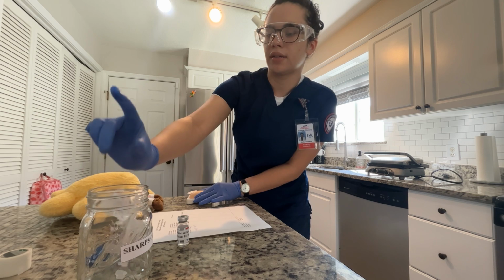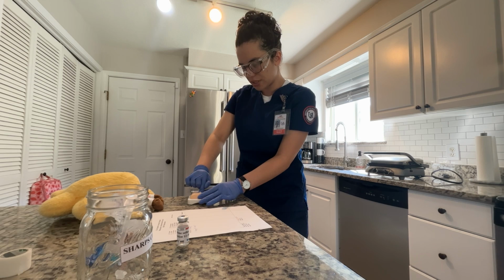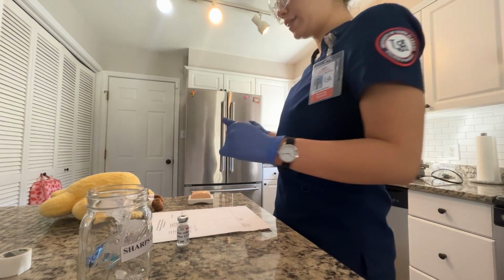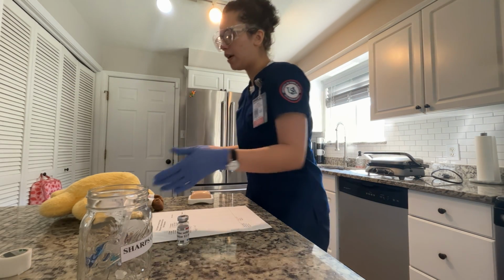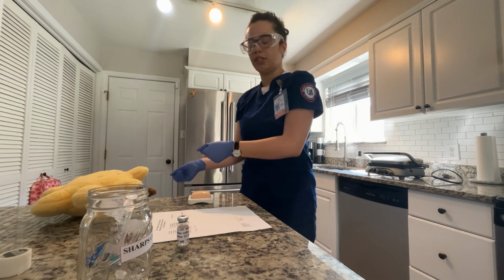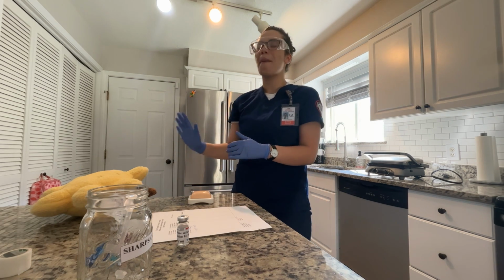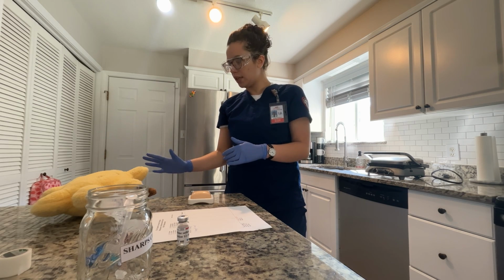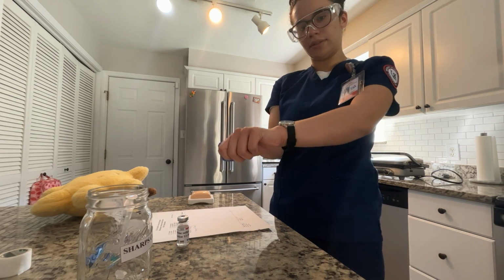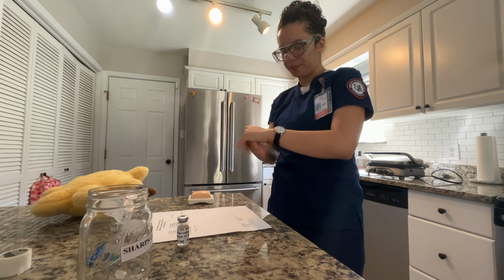I'm going to put my needle in my sharps container. I'm going to apply pressure so that Mr. Jones doesn't bleed. You did very well, Mr. Jones. So now that all of my sharps are disposed of, I'm going to put Mr. Jones back to a comfortable position. I'm going to move the side rail up and then lower the bed to the lowest possible position. Going to be removing my gloves and disposing of those. I'm going to perform hand hygiene.